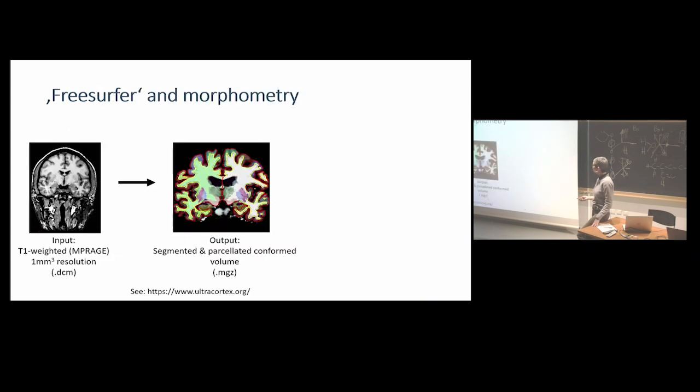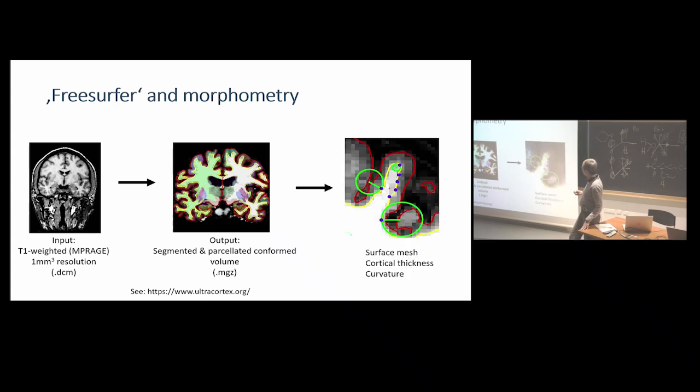Okay, so what do people do when they do this segmentation, computational neuroanatomy? Well, this is, I guess, what they will typically do. They would just acquire this image here with a decently high resolution, and then they will segment it. There are a lot of tools for that, FreeSurfer, voxel-based morphometry, and then you can start to look actually at the surface of the brain too. So you can look at cortical thickness, quite popular. You can look at how the brain is folded, so you can study folding patterns with it. You can do a lot of fun things.